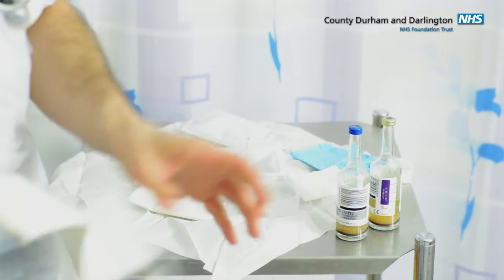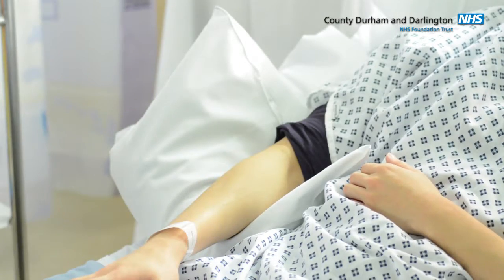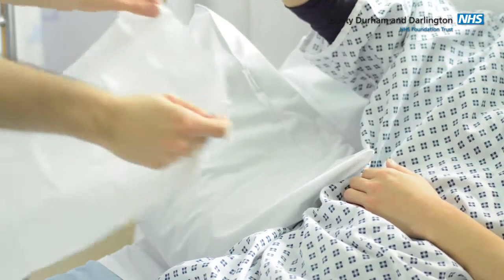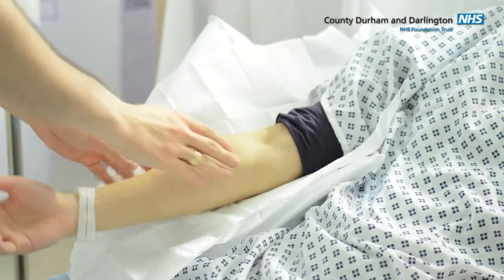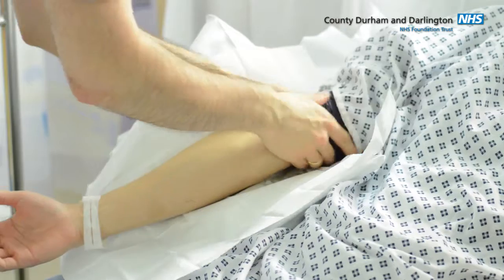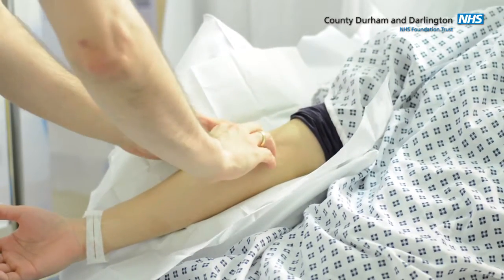Just going to place this drape underneath your arm, okay? Can I just ask you to lift your arm, please, sir? Place a drape underneath the patient's arm. It's fine. You can rest it down. Just gonna roll up your sleeve.